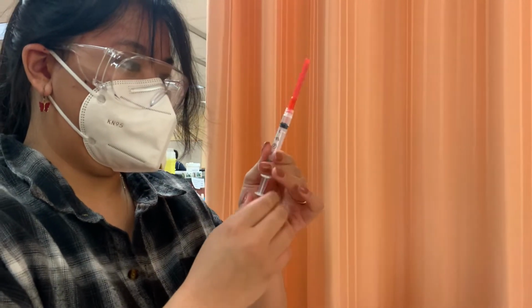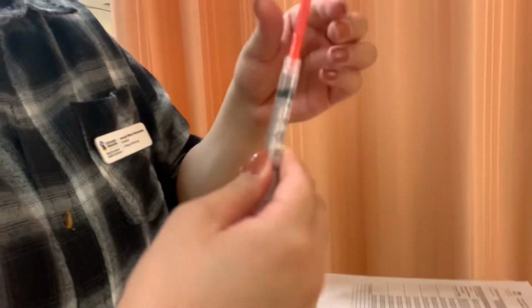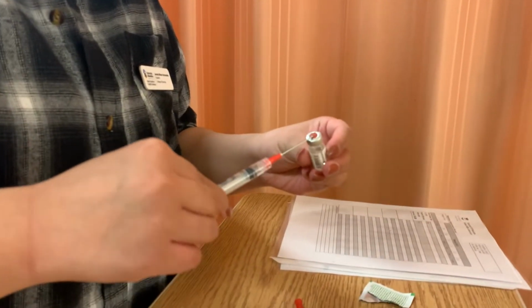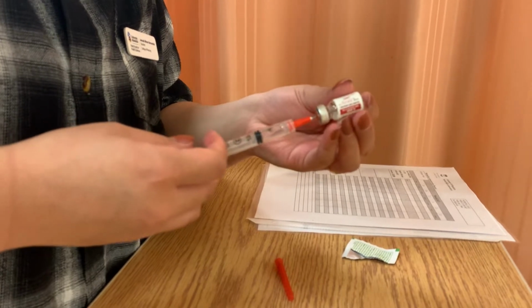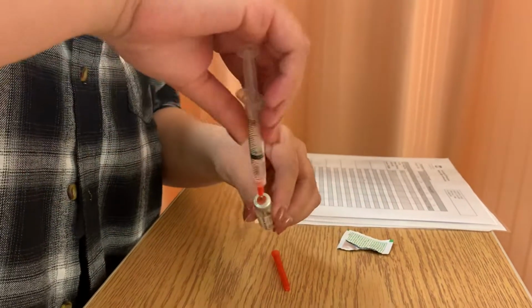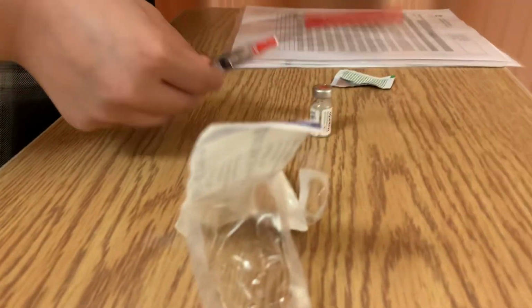Well, there's some fluid inside. Shouldn't be, but yeah. Let's see there. 0.5 ml. I'll be injecting it in. Perfect. Injecting the air in. Let us know right away any signs of bleeding in the gums. Okay, so I pulled enough fluid. And you just do the scoop method. Yeah. Report any of the signs.